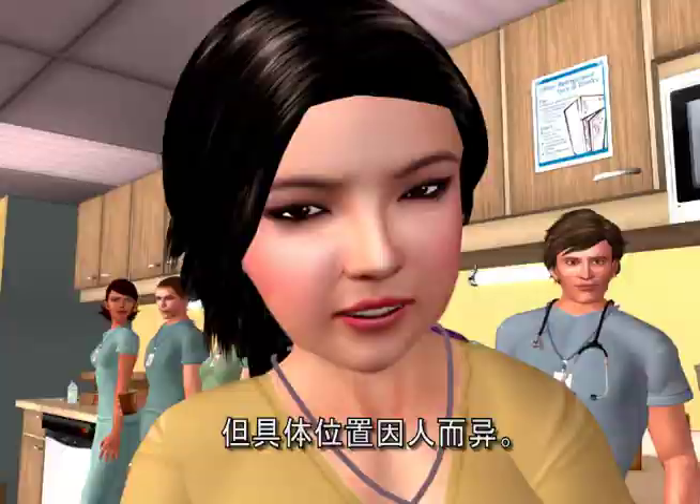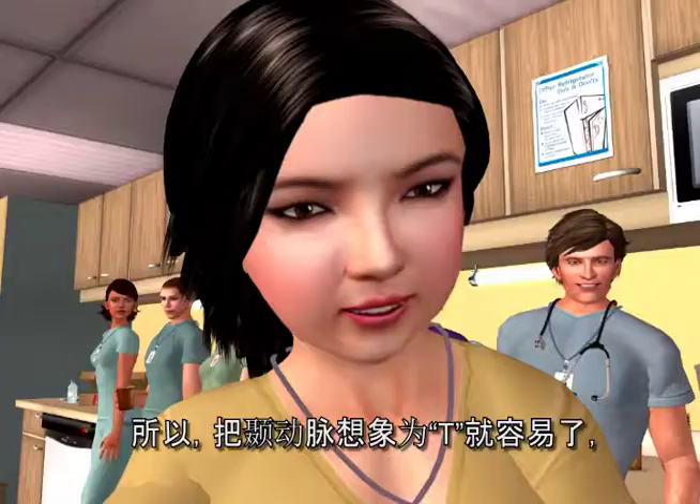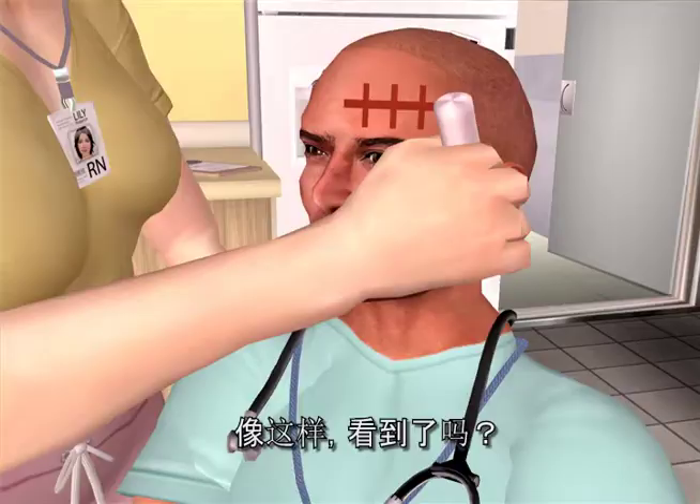The superficial temporal artery is up in the forehead, but varies in exact location from person to person. We need to cross the artery, so think T for temporal artery, and the rest is easy — just cross the T's. Not this way.